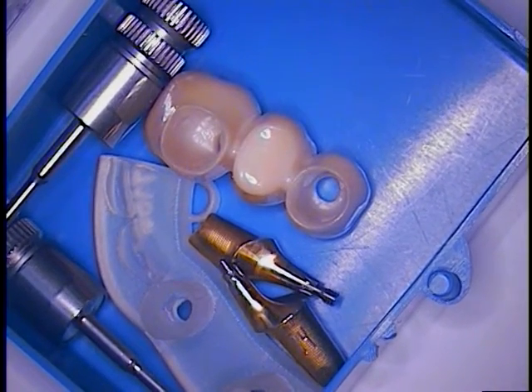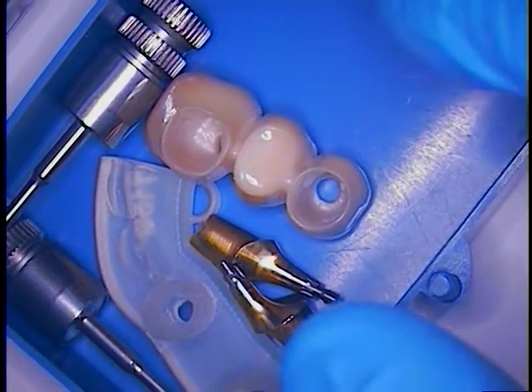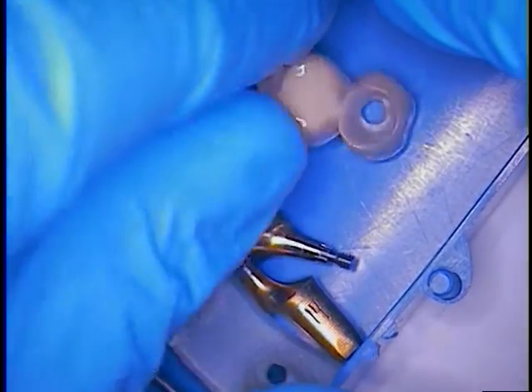Hello, good morning and welcome. This is Dr. Jerry Cuomo. I'm filming live here in my Boca Raton dental office and this case today is the Ankylos case from Dent Supply.